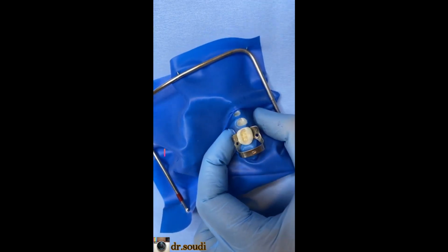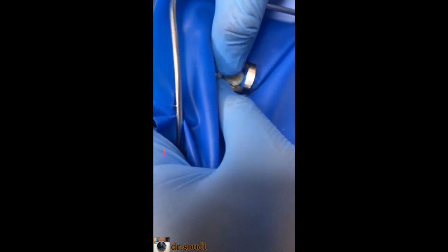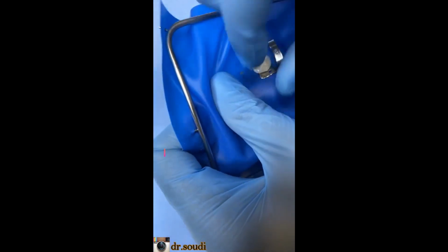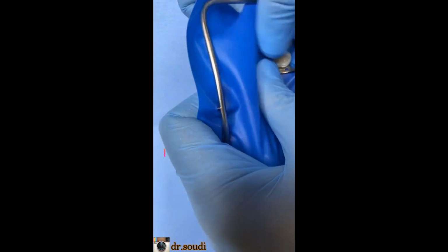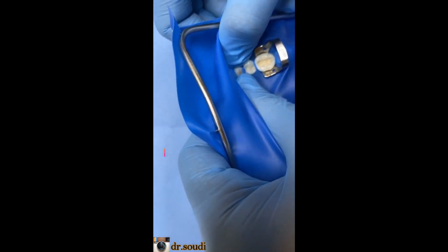We tested the clamp first, right? Like this, okay? Then we need to pass the septa first. The septa is the part of the rubber dam sheet between the 2 holes. It's called the septa. Okay, you need to place the septa first between the teeth.